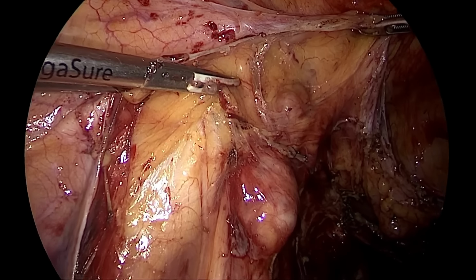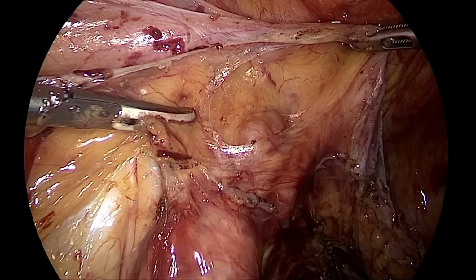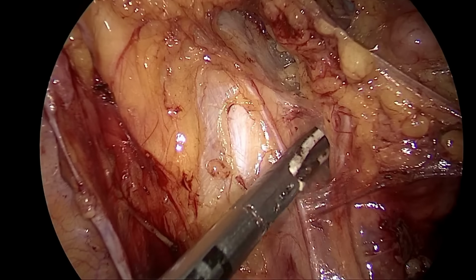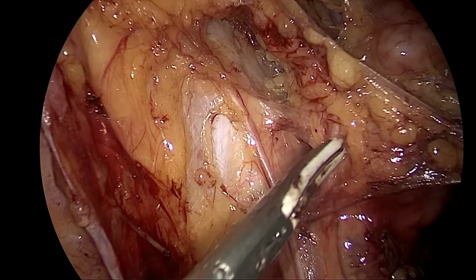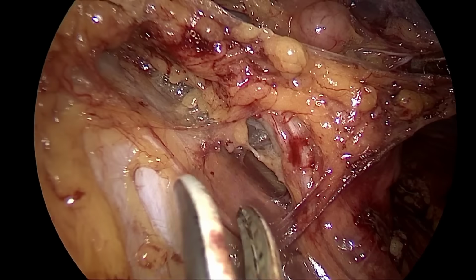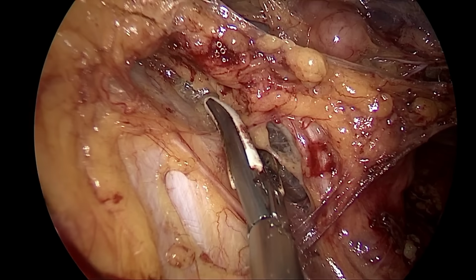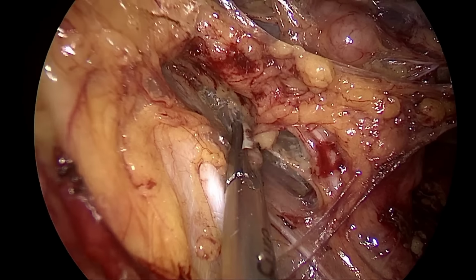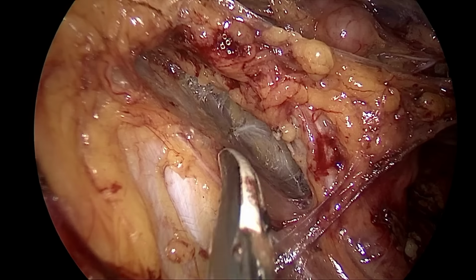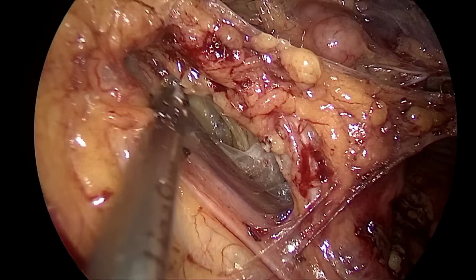Firstly, on the lateral of the external iliac vessel on the psoas major muscle. Now in between the psoas and the vessel. So on the left hand side, you can clearly identify some large nodes are visible. So through this lateral approach, we reach up to the level of the pelvic floor initially.